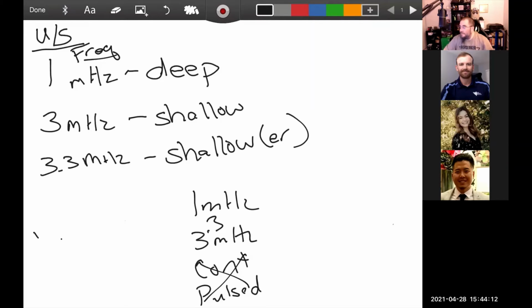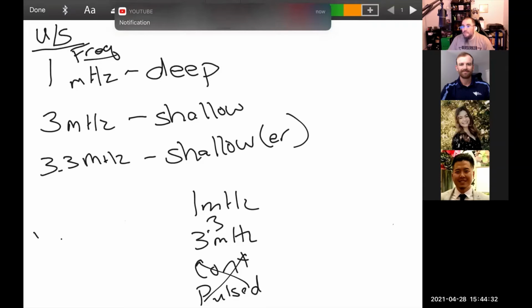Yes, and I think if you put it over, doesn't it almost make it want to fuse together? Yeah, it can. Or the worst part, it can vibrate it apart a little bit, and it causes them that growth. We all encountered that when we were growing up, right? You had those growth pains. You can cause those to kick in by hitting ultrasound over them. Okay. And what is the age of that when they're fully developed? Is it 21 or 18?